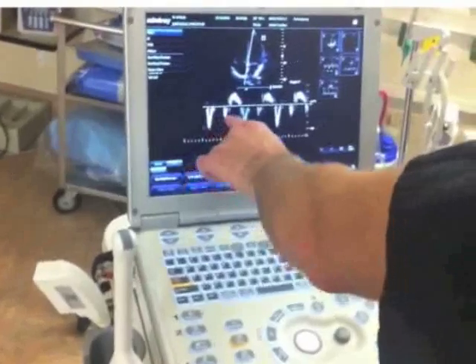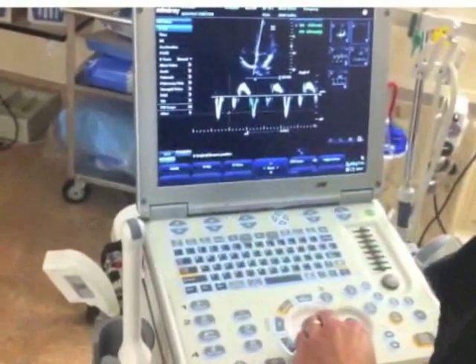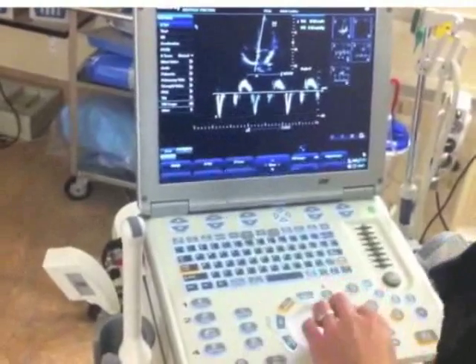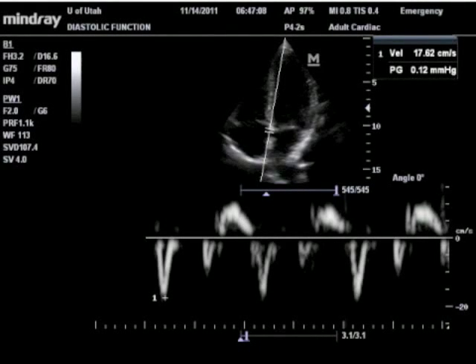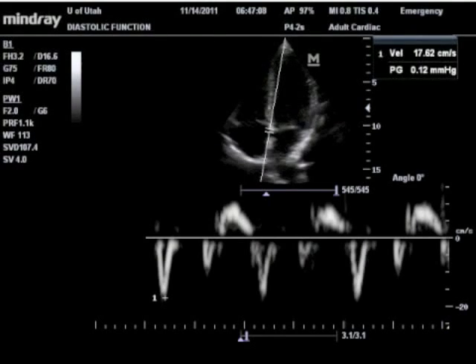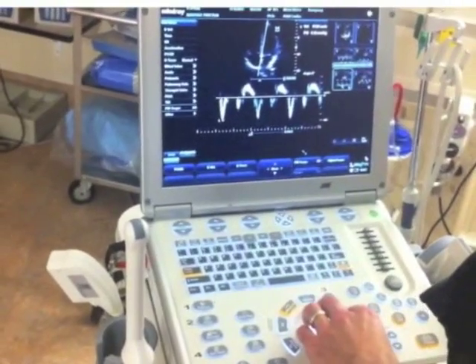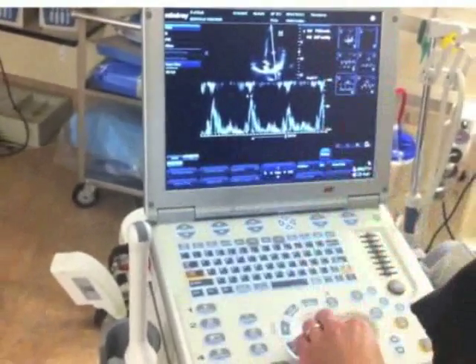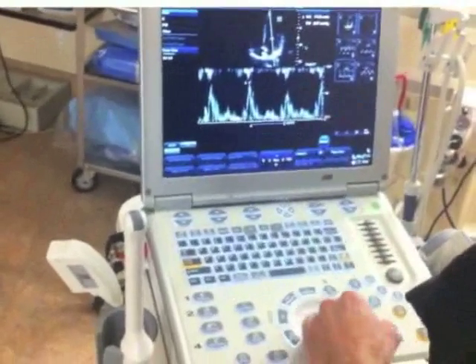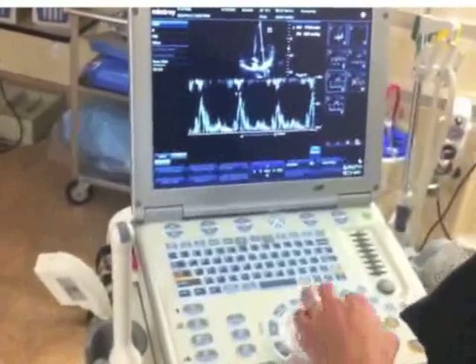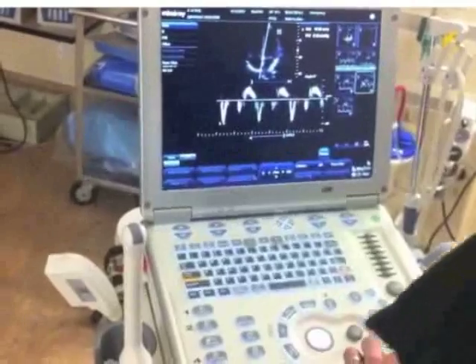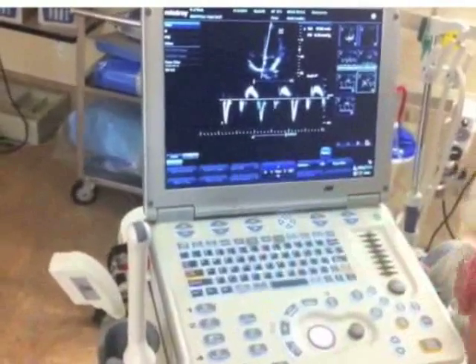So here we have E prime, A prime, E prime, A prime. If I measure the E prime, I'm measuring at 17.6. Looking back at Phil's inflow velocities, his inflow velocity was 71 and his E prime velocity was 17. So the E over E prime would give me an estimate of his pulmonary capillary wedge pressure.